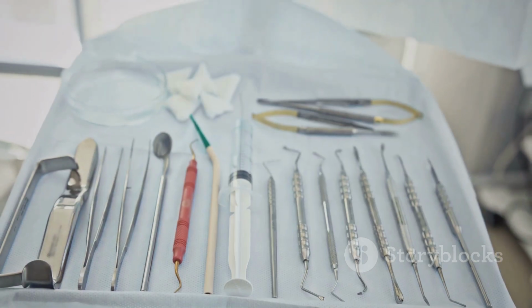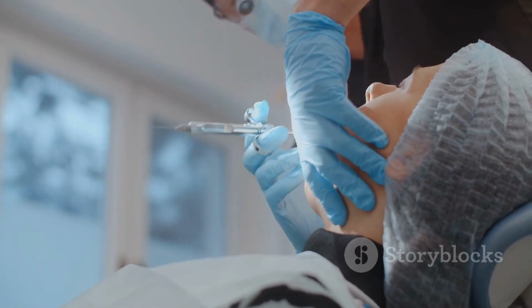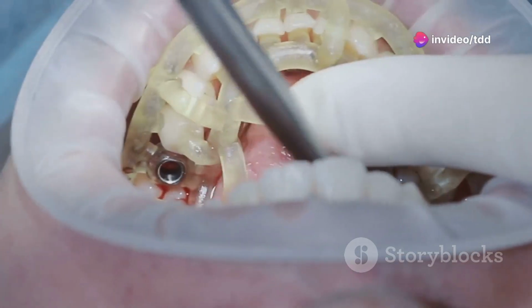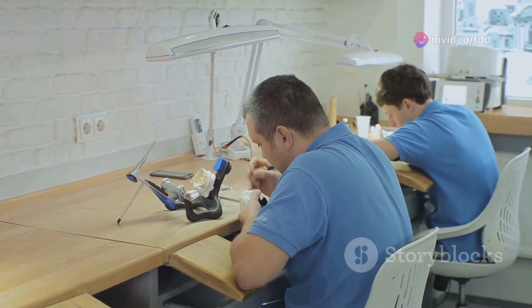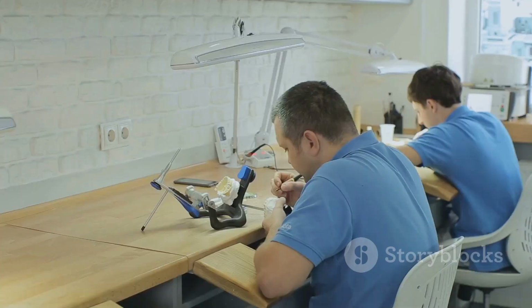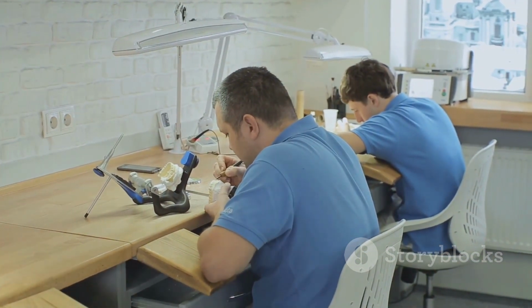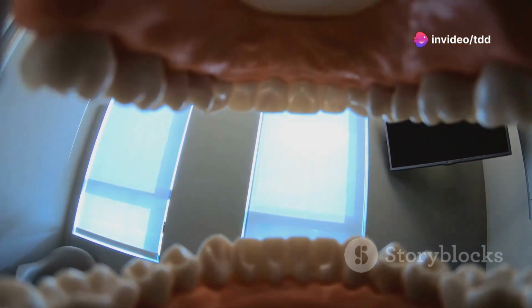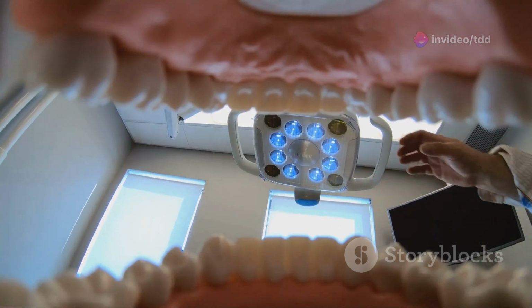Step 3. Implant surgery. Now for the surgical phase. Here's what happens. Local anesthesia or sedation to ensure the patient is comfortable. Incision, where a flap is raised to expose the bone. Osteotomy, using a series of drills to create the implant site. Implant placement, where the titanium implant is inserted into the prepared site, acting as the root of the new tooth. And finally, suturing, where the flap is closed over or around the implant, depending on the healing protocol.